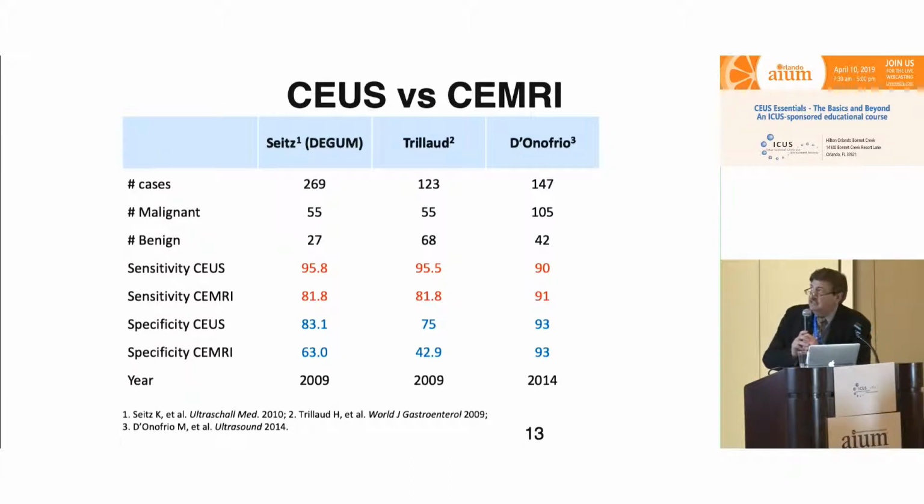If we look at the studies that have directly compared CEUS and enhanced MRI, we have 3 studies. In 2 of the studies, the sensitivity and specificities were higher with CEUS, and in the 3rd study, they were basically equivalent.